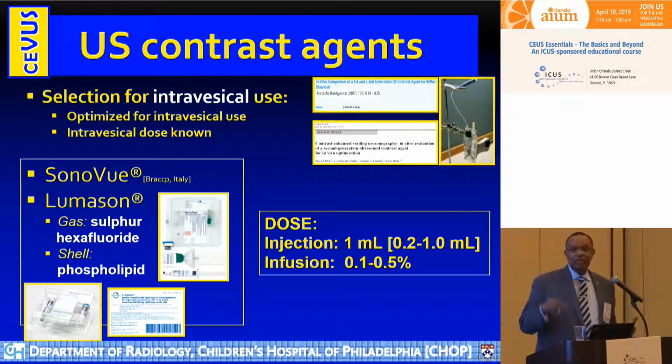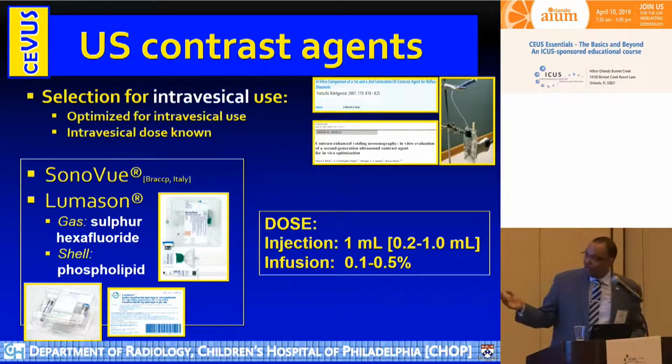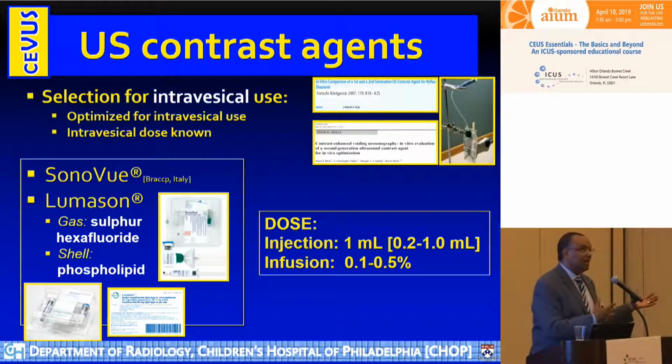It's hard sometimes to approve things based on potential future things. So based on that, they said use 1 ml, inject 1 ml, and then scan and see whether there is reflux. However, what happened in between the FDA's approval? The FDA approved it based on the literature before the approval. But once FDA approved it, what happened?